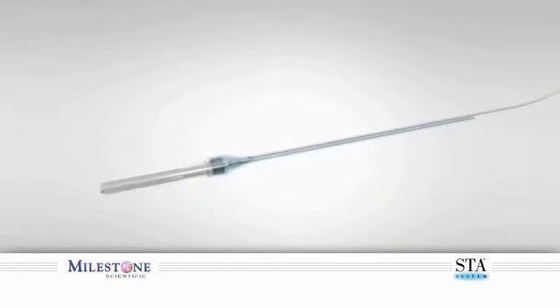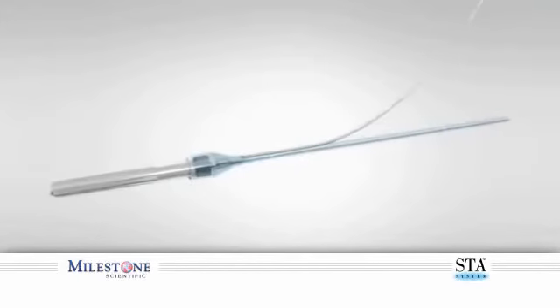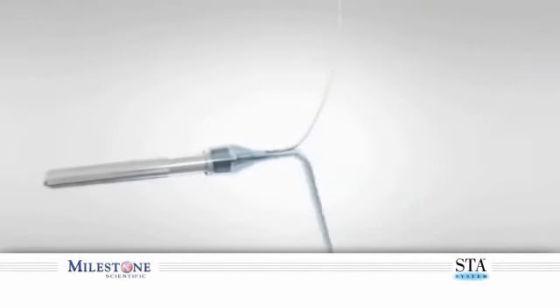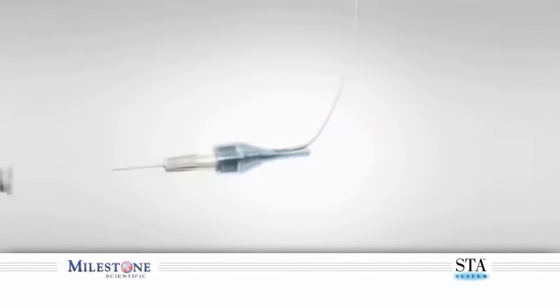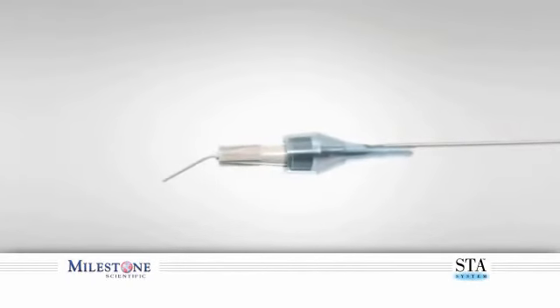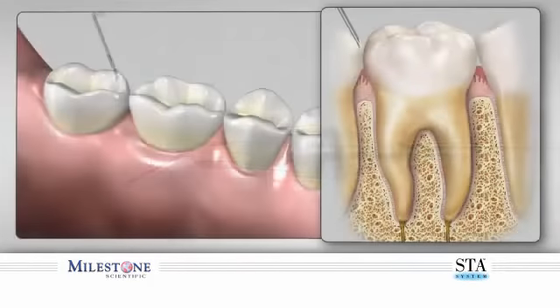It is important to have direct vision of the needle as it enters into the gingival sulcus. To improve accessibility in difficult areas, shorten the STA handpiece by breaking off a section of the handle. It may also be necessary to bend the needle for proper needle placement. Bend the needle no more than 45 degrees. Bending the needle bevel toward the handpiece allows easier access to the distal root of mandibular molars. The needle bevel should face the root surface during needle entry into the sulcus.